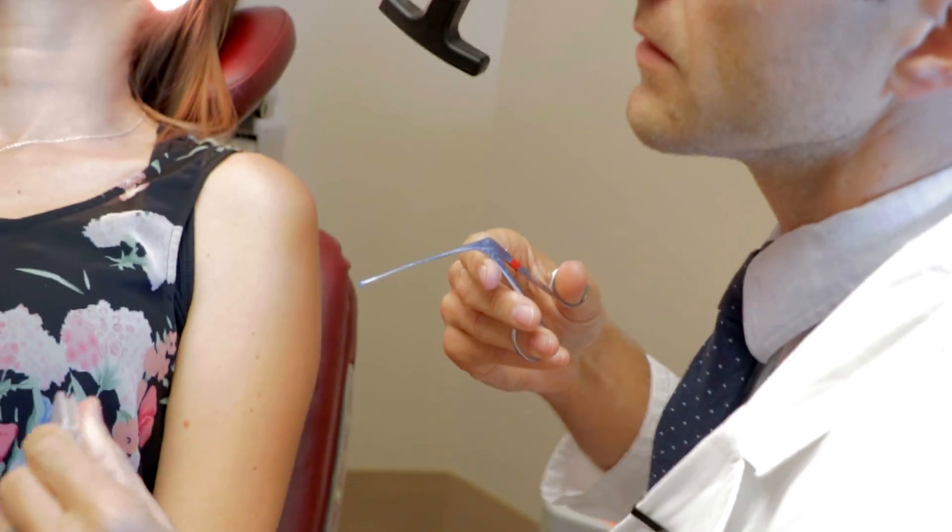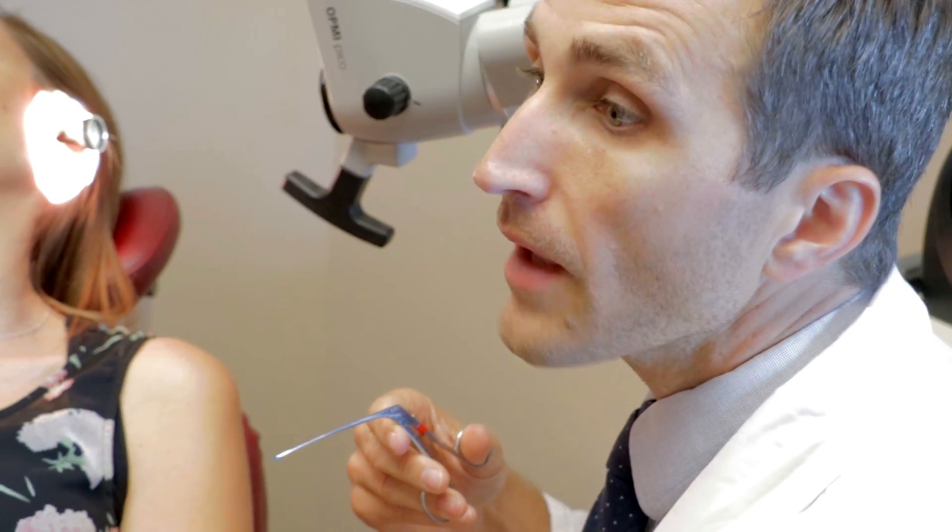And I'll need that straight pick too. I don't know if Dr. O has one here. Oh yeah, he does. Perfect.